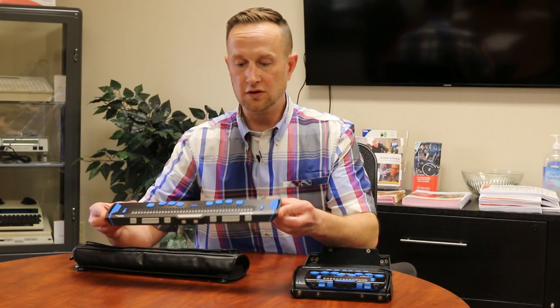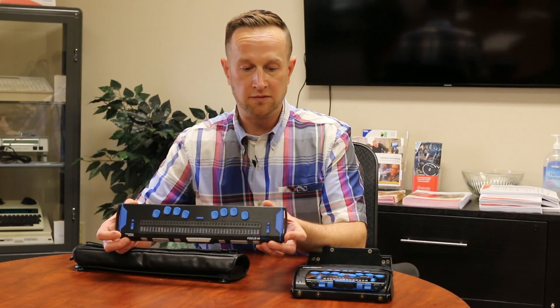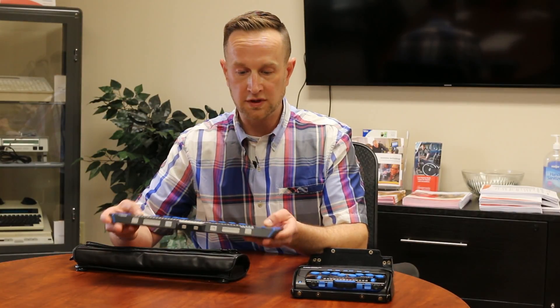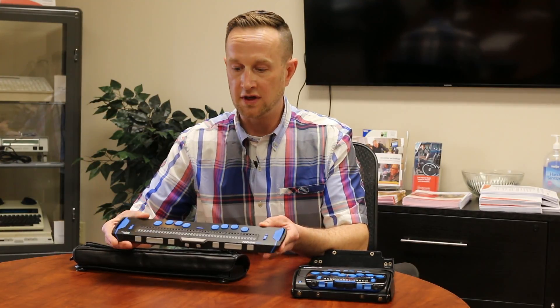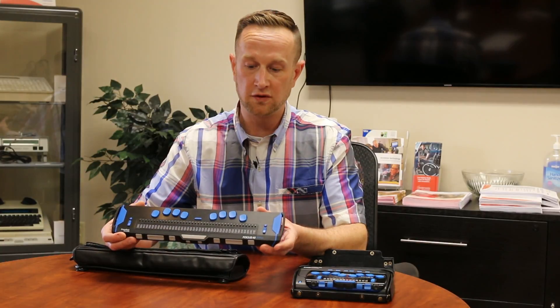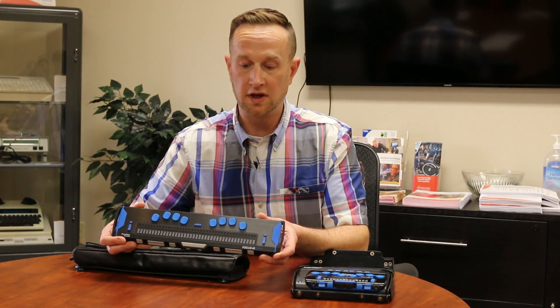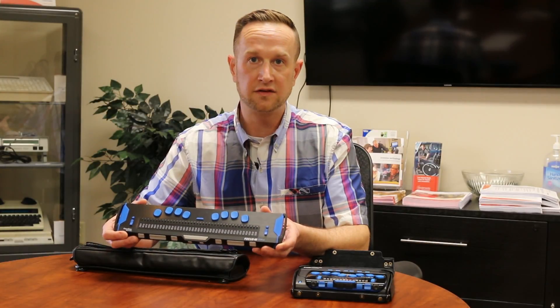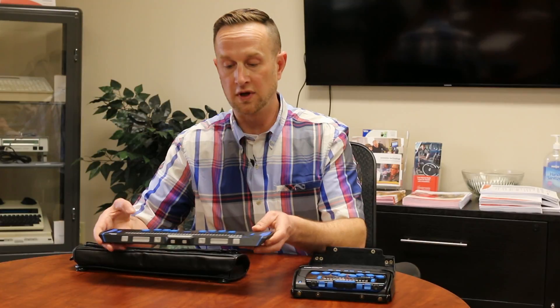The new Focus 40 Blue Braille display has been released as well. It's got a little more of a rugged feel to it — really nice. It still has all the functionality of the Focus 40 4th generation, but this is the 5th generation Focus 40, which is now available. There will soon be an L Braille 40 docking station note taker available for the Focus 40 as well.